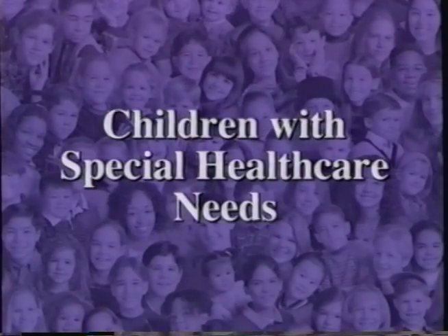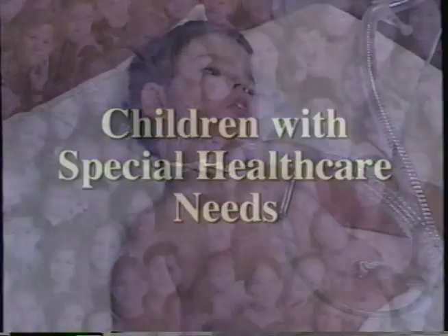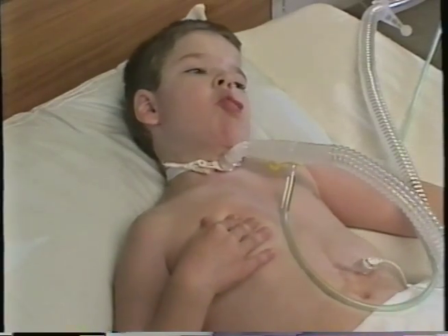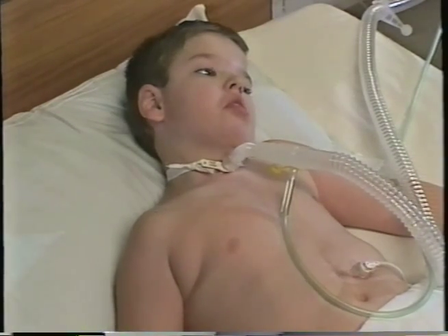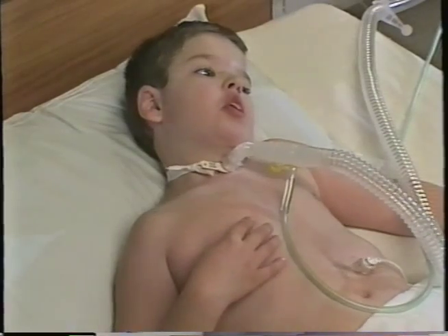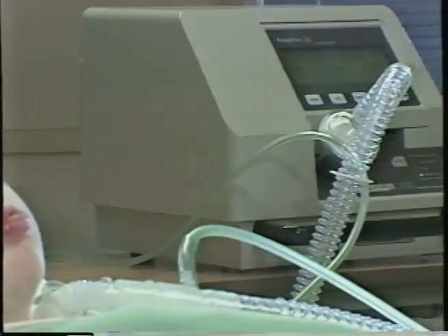Children with special health care needs are children who have chronic physical, behavioral, developmental, or emotional challenges, who often require unique health-related services which are not typically needed by the average child. Many of these children are technology dependent. The general principles of PALS apply, but their technology dependence creates a special resuscitation circumstance. This video demonstrates common technology and selected interventions.